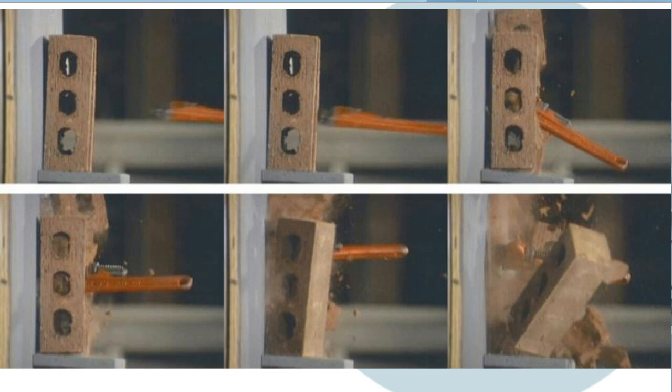If you start in the upper left-hand corner and go top row left to right, and then jump down to the bottom row and again left to right, you see these frames in sequence. What you don't see is to the left of each one of the frames is an MRI scanner, and that gray plane behind the brick is a piece of gray painted plywood, and there's a little shelf, and the brick is standing on the shelf.